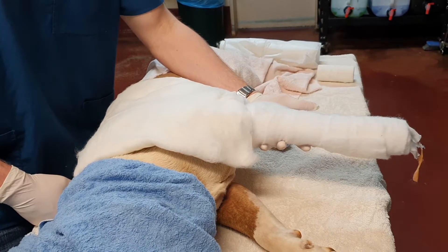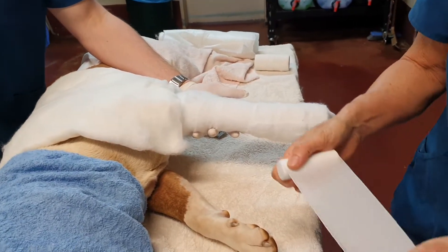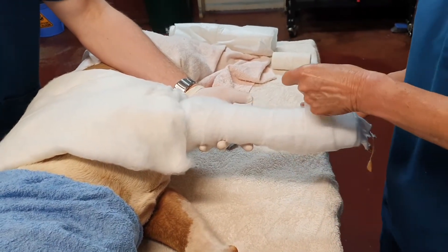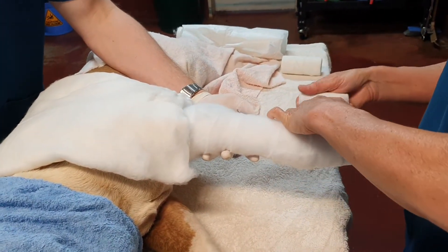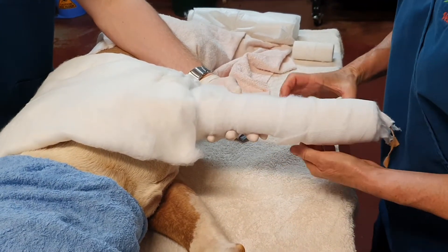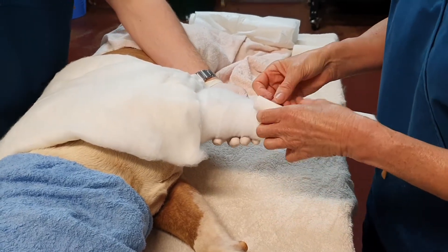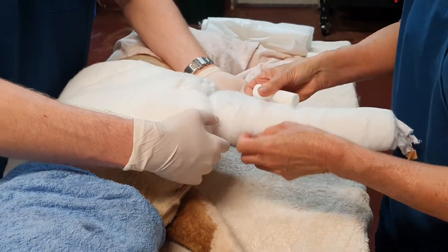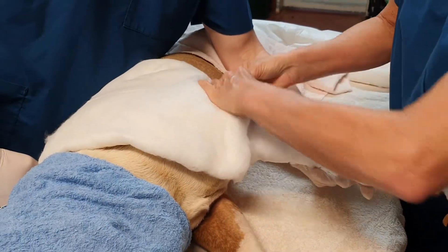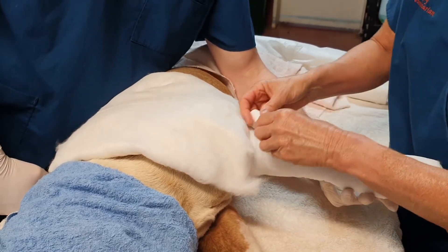We'll use this stretchy elastic conforming bandage. Same as with the lateral splint, we start distally. Toes are just here. Just unwind it without too much pressure, keeping just a 15-degree bend at the carpus. You really do need an assistant for this one. When I get to the elbow, I tend to figure-eight around the elbow a little bit. We've got the donut underneath the soft band.